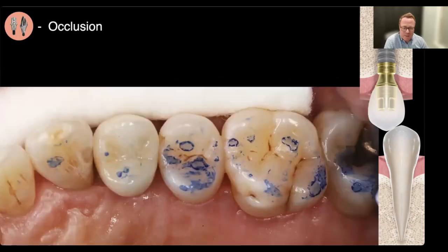And so here's just an example, the premolars, the implant crown, and here you can see a nicely adjusted implant crown occlusion. So you can see the heavy contacts on the teeth around the implant when they clench really hard. And when they're clenching, there's no contact on the buccal cusp. And you can see three smaller point contacts on the implant when they're clenching down really hard. And at this point, I would love for that to be a little bit more centrally located, but at the same time, that's pretty close and that works well.